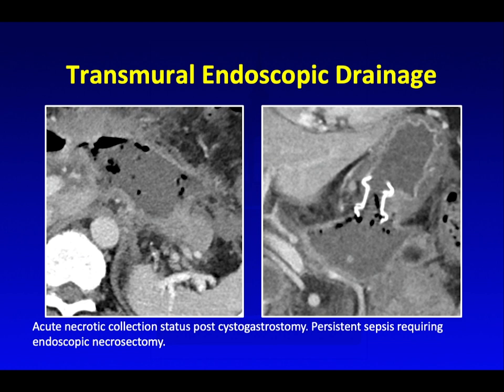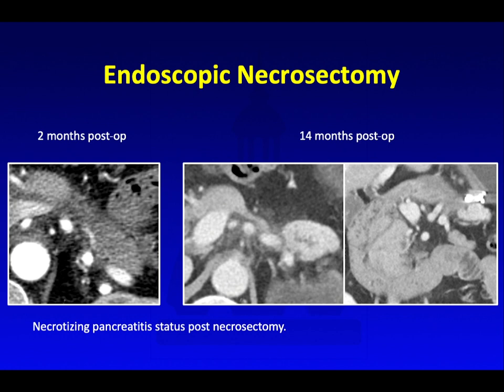This patient had persistent symptoms despite transmural endoscopic drainage and had to go on to necrosectomy. Two months post-op, you see ill-defined tissue at the necrosectomy site. At 14 months post-op, this area is basically totally scarred down and we don't really see much of any remaining pancreas at that site.